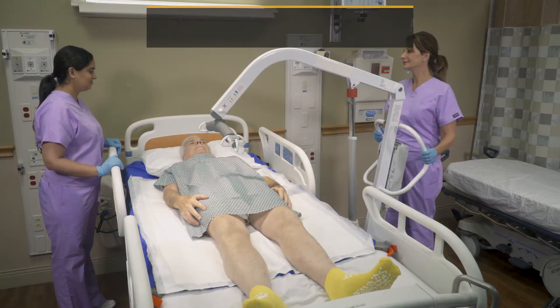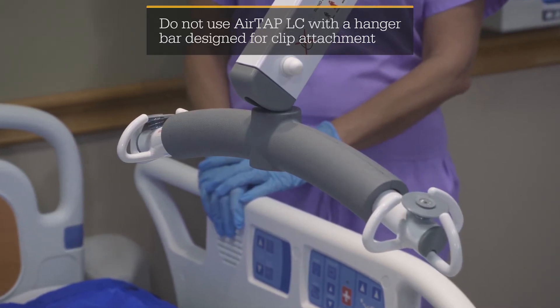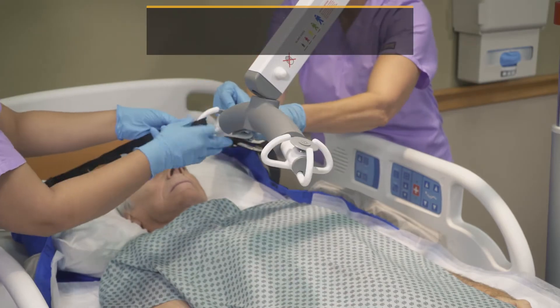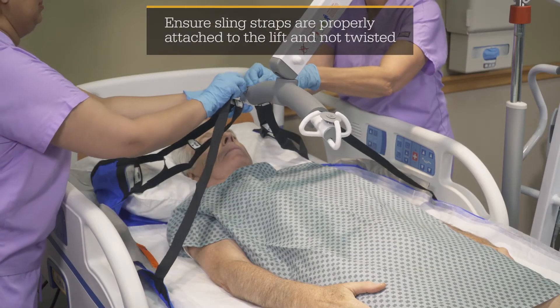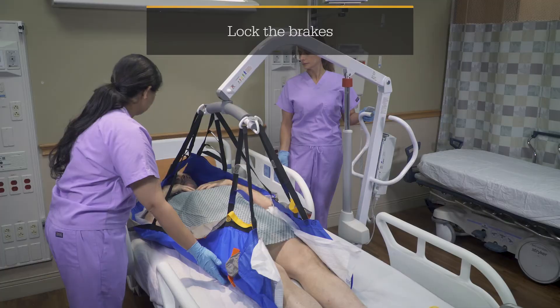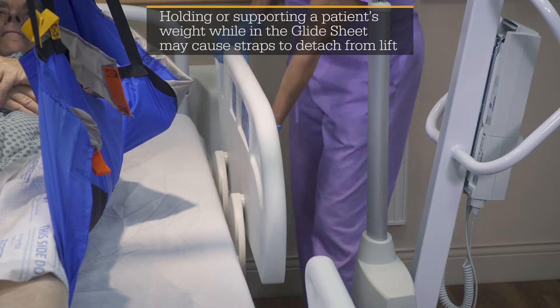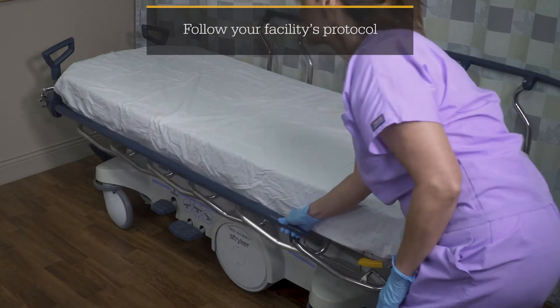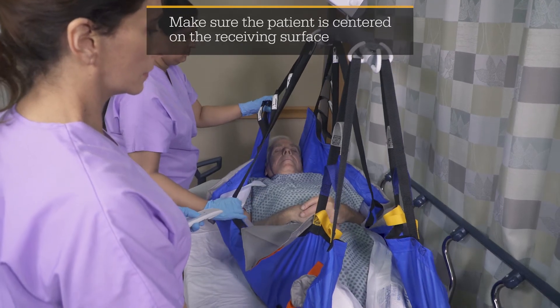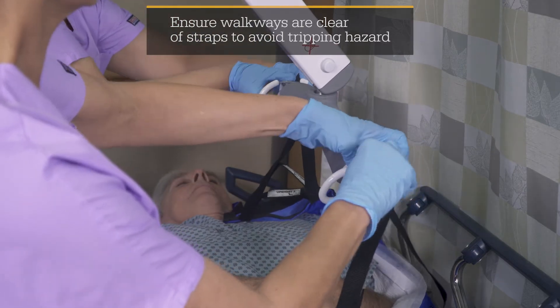Before performing a supine lift transfer, ensure the bar attached to the lift is set up according to the manufacturer specifications and your facility's protocol. Attach the supine top sling straps to the lift, then attach the middle sling straps. Attach the black bottom sling straps last. Use the lift to raise the patient above the support surface, lower the rails on both support surfaces, and transfer the patient to the receiving surface. Lower the patient until the sling straps are no longer in tension, then remove the sling straps from the lift and tuck them out of the patient's reach.